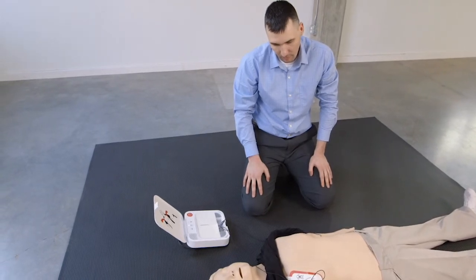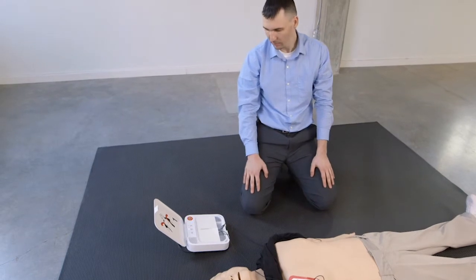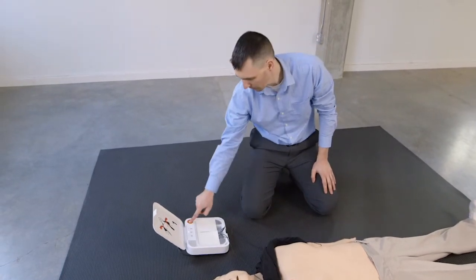Preparing to shock. Everyone clear. Press flashing button. Shock delivered.